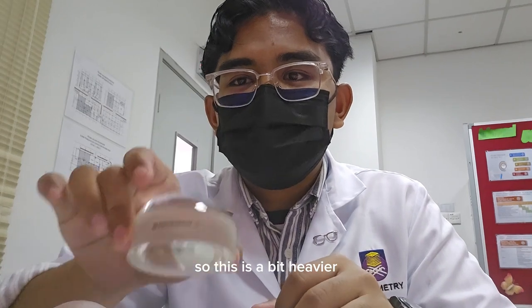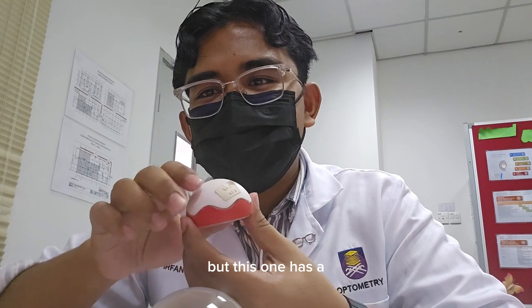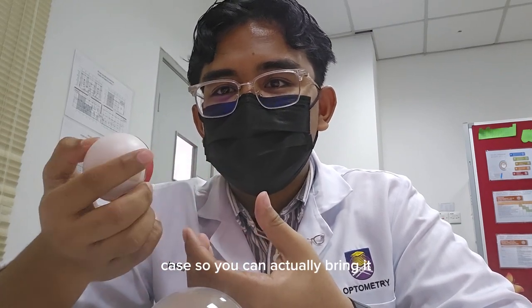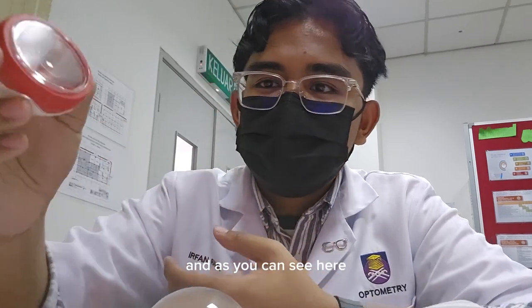This larger one is a bit heavier, so it is really hard to move around. But this one has a case, so you can actually bring it when you're travelling to other places.